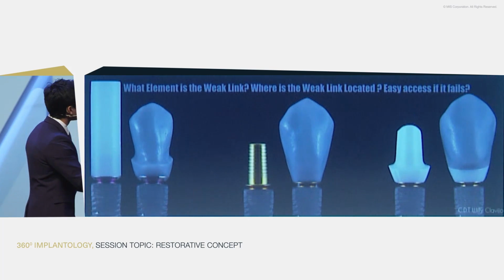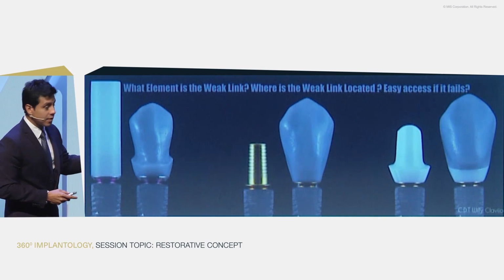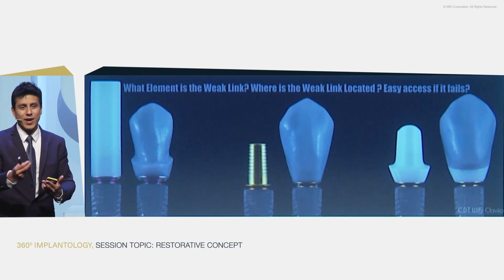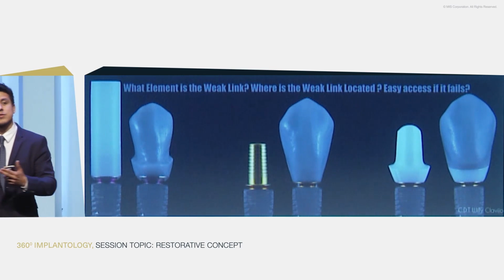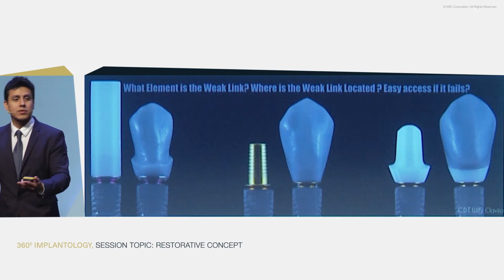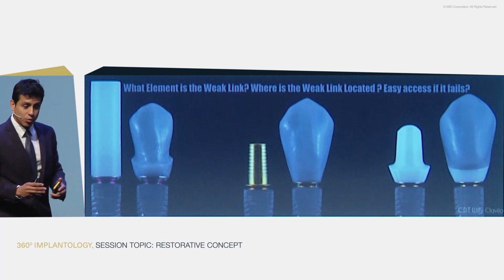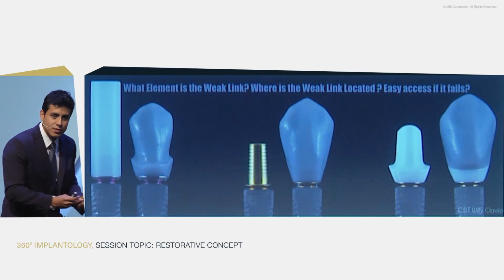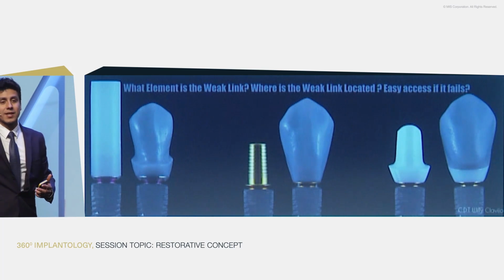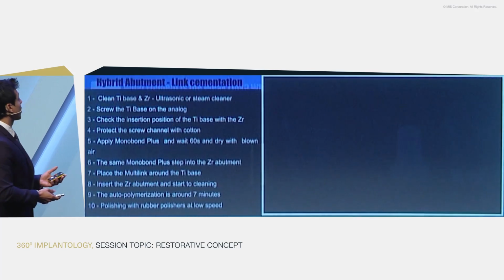But if you work with a T-base, with zirconia or lithium disilicate, if you have one problem, probably the problem will be the bond. It's difficult to fracture the disilicate or the zirconia restorations. So if you have a debond here, you have to cement again. So your risk will be low. And also it will be retrievable, and managing this failure is easier. If you have one problem with the crown, you can mill it again from the CAD-CAM, and you have a new restoration in an easy way. So these are our options.